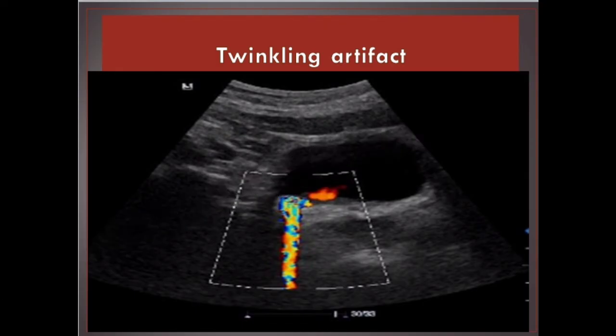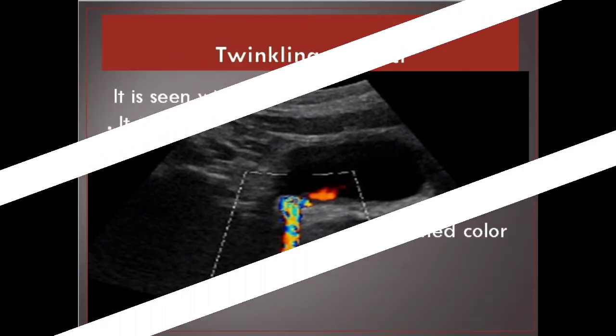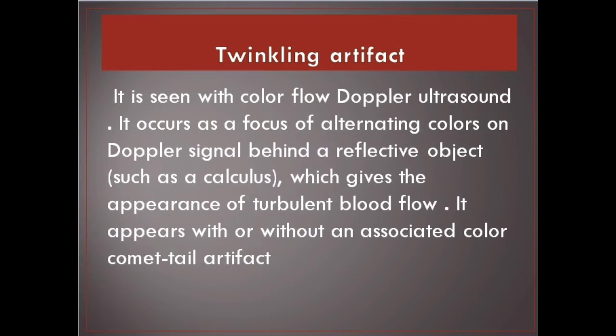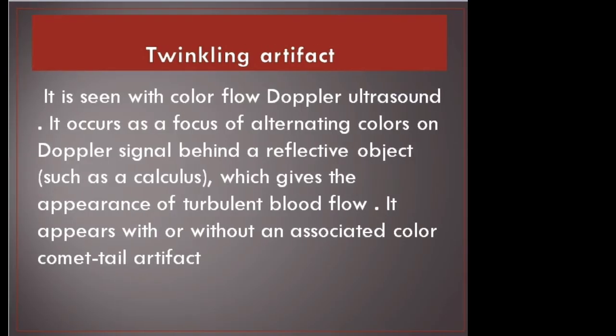Twinkling artifact. Twinkling artifact is seen with color flow Doppler ultrasound. It occurs as a focus of alternating colors on the Doppler signal behind a reflective object, such as a calculus, which gives the appearance of turbulent blood flow. It appears with or without an associated color comet tail artifact.